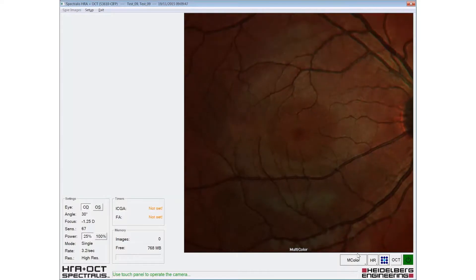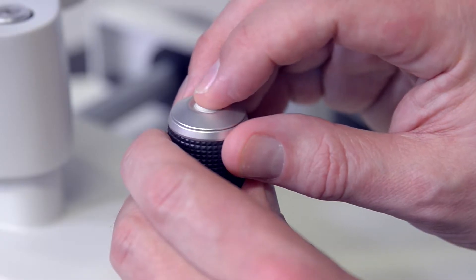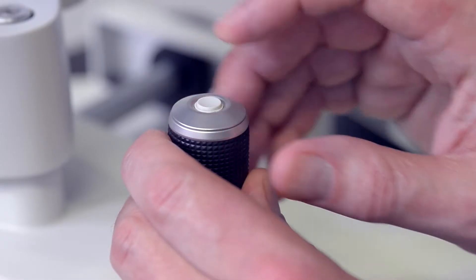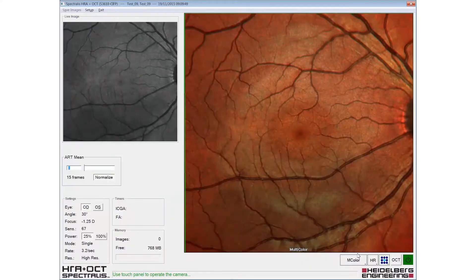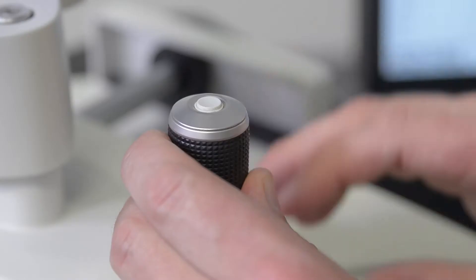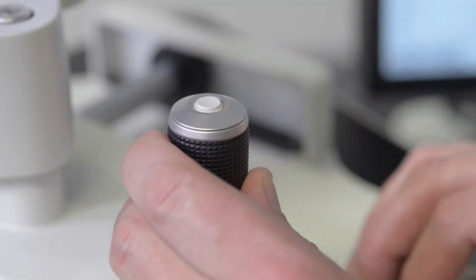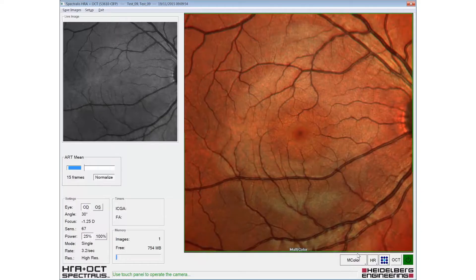Eye tracking and automatic real-time is engaged with a long press of the joystick button. A short button press acquires the image once the desired number of frames has been reached.